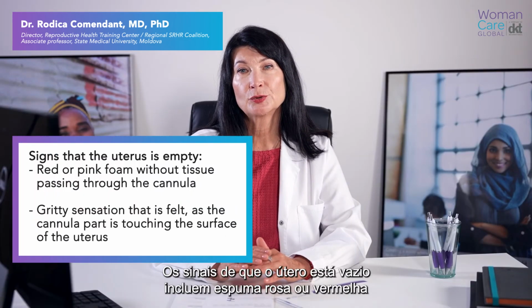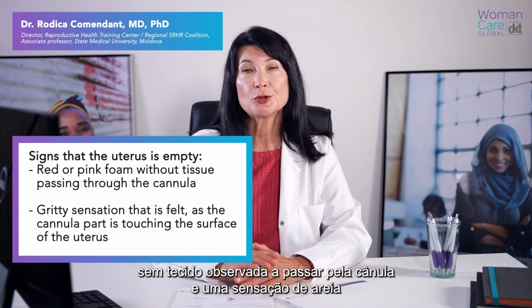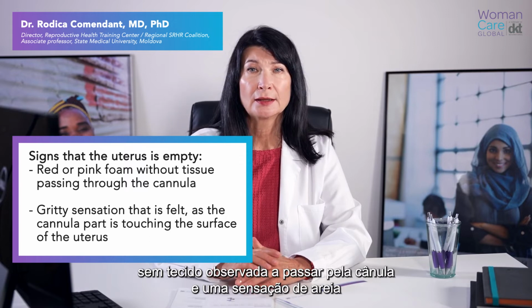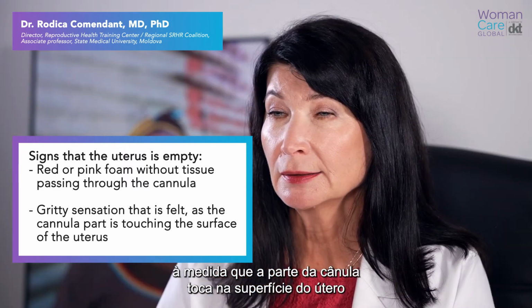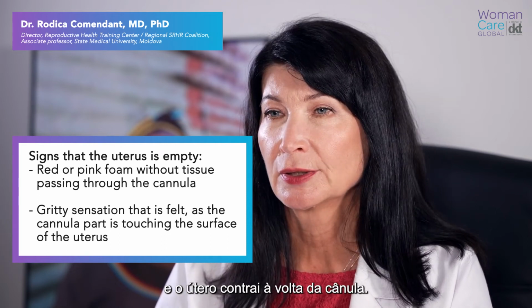The signs that the uterus is empty include a red or pink foam without tissue that is seen passing through the cannula, a gritty sensation that is felt as the cannula is touching the surfaces of the uterus, and the uterus contracts around the cannula.